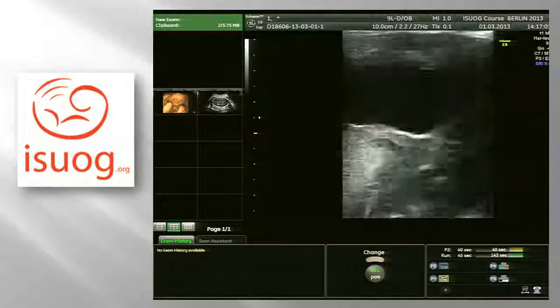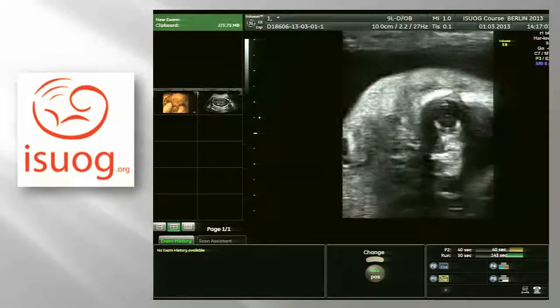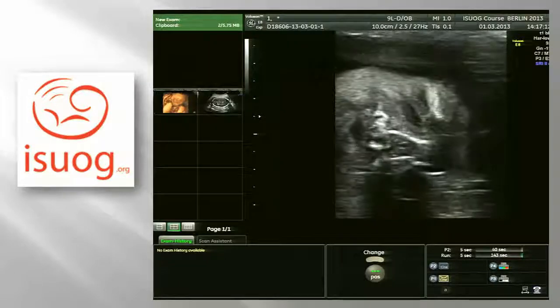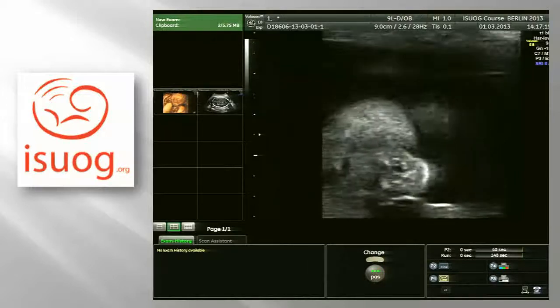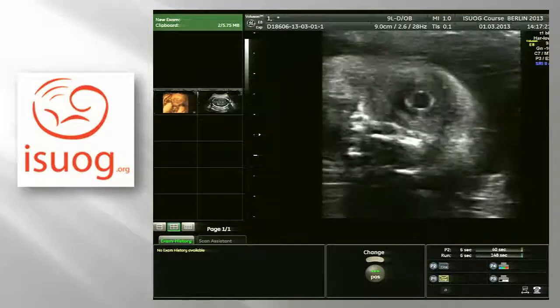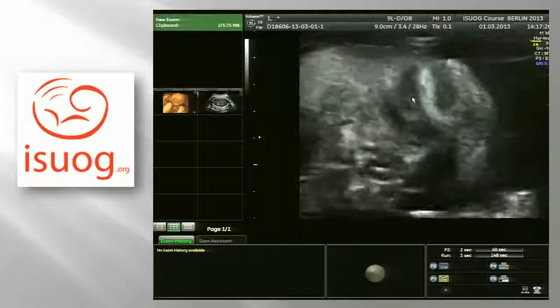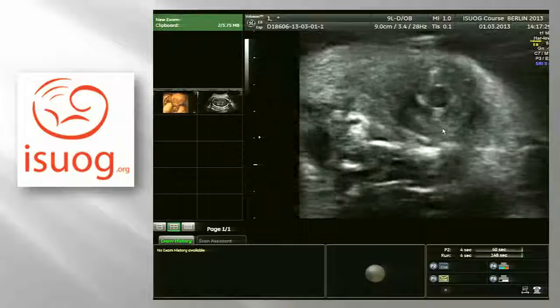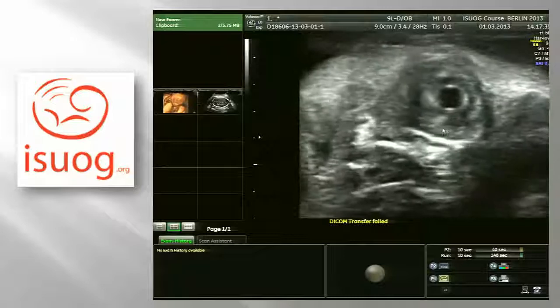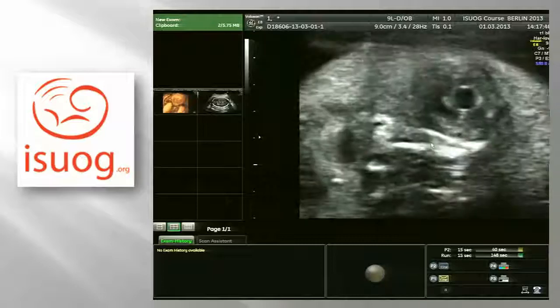This one is only around 24 weeks, so I will try to do it anyway. We can see the eyelid, it's closed. At this stage, the baby cannot open the eyelid. It's not possible until after 26 weeks. So we can see here the lenses. But it's a little bit too early to demonstrate the pupil. And in my lecture, it was a fetus at 32 weeks of pregnancy.